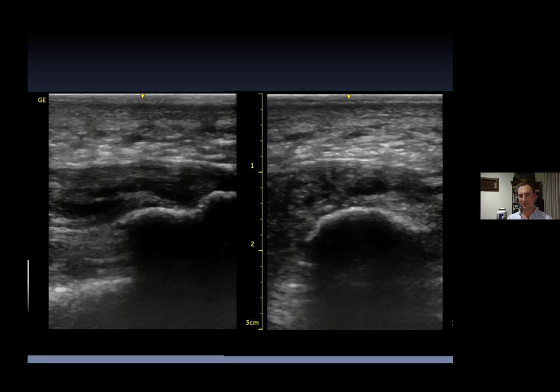I don't know if I asked this, sorry. Do you use shockwave for osteoarthritic pain? Yep, I do. I do have the occasional patient. You've got to choose the right patient because it's uncomfortable depending on where you're treating, particularly if it's around an ankle joint. It's very bony areas.